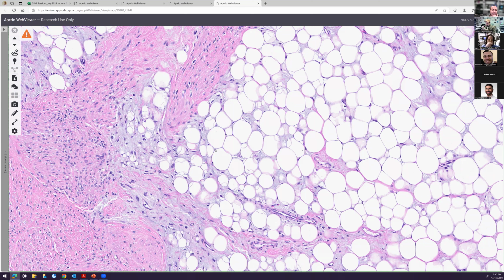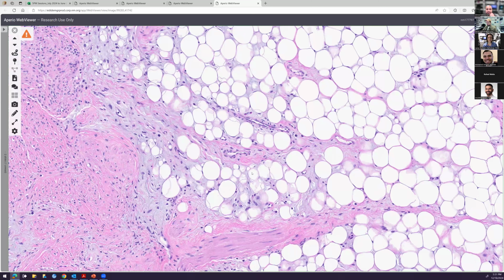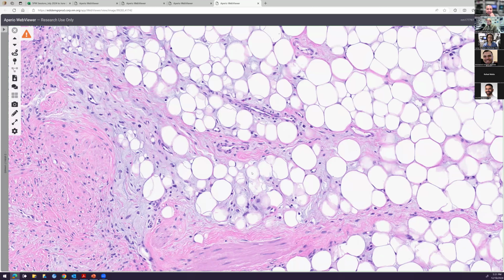If it's a child, I would consider lipoblastoma as well. All right, great. An intramuscular lipoma? Well, intramuscular we give to skeletal muscle, but not the smooth muscle of the wall. We wouldn't really call that. But it could be just a regular lipoma of the bowel wall. That's true. Okay, so something that Alcino has pointed out here, these smaller cells, he's noted the presence of that fibrous tissue and some of the myxoid change, and these little guys, which are lipoblasts. So he wants to give us a lipoblastoma diagnosis, and I think that's a fantastic idea.